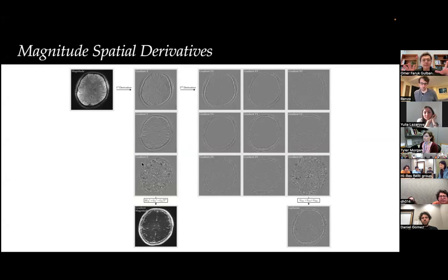If it's your first time seeing these things, I know that it's not so easy to just grasp what these are, but basically you look at a voxel, you look at the voxel right next to it, and you compute the difference between them. That's a measure of a first spatial derivative. You can do it in more complicated ways, like what is upper, what is lower, and so forth, to compute these spatial derivatives. This is just the first spatial derivative, though.